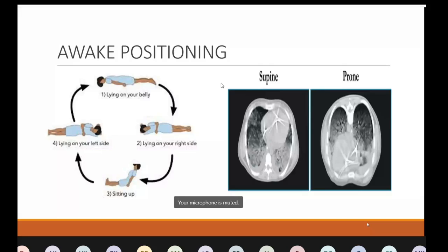Yeah, hypotension may be due to high peak pressures. These are some complications. So I think now you have some idea about how you will do. You try to change the mode to ST mode. If the only problem is oxygenation, increase CPAP, and if the patient still has tachypnea and is using accessory muscles, increase IPAP. So these are the things that you will do.